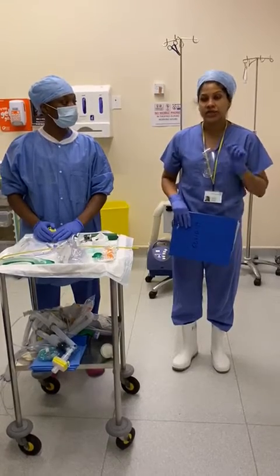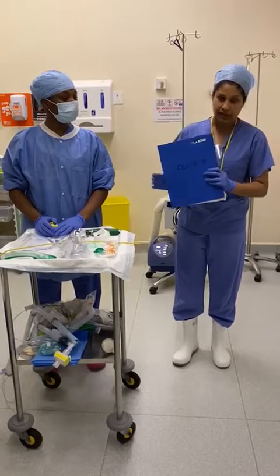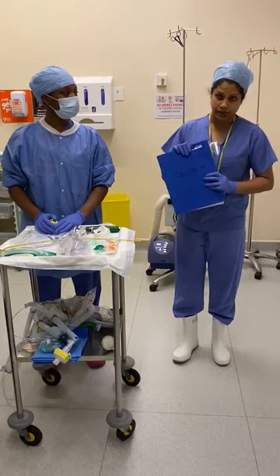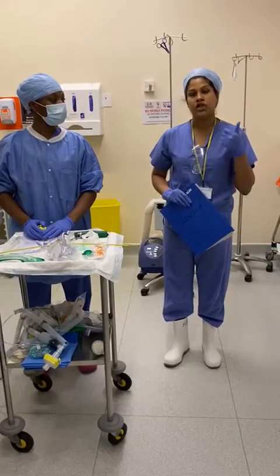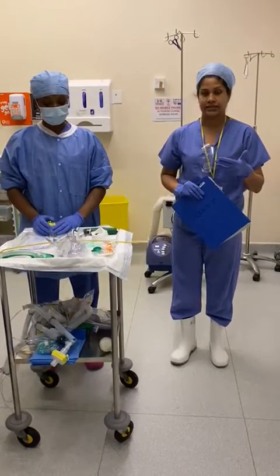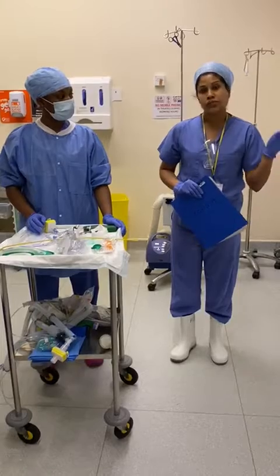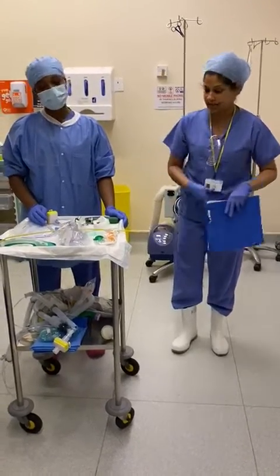There's a few bits of kit that you need to take before you go downstairs. You take your COVID file. This has a checklist for intubation and a checklist for donning and doffing as well. You grab your PPE, airway equipment, bougie, McGrath blade, clamp, and FONA kit, the front of neck access kit, from your COVID cupboard. There's a set of intubation drugs in the fridge. You grab that as well. Grab all of that kit and you go downstairs.